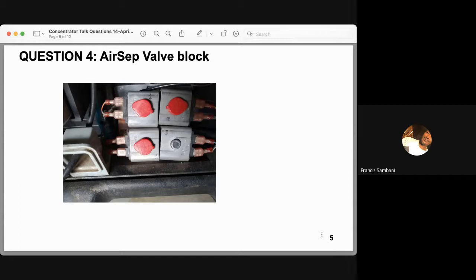If you measure the resistance of the coils and find a lower resistance or no resistance than specified, it means that the valve is damaged and needs replacement. This is one way of determining if a valve is damaged or not. But you can also determine which coil is not operating by checking each valve to see if it becomes energized or magnetized during unit operation. To check for coil operation, you follow a couple of steps, and the first is to remove a plastic cap securing the valve coil to the valve stem.